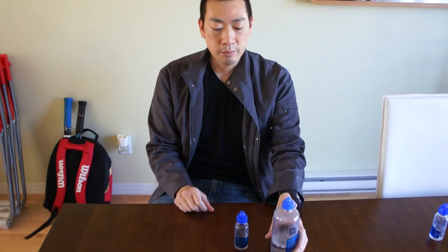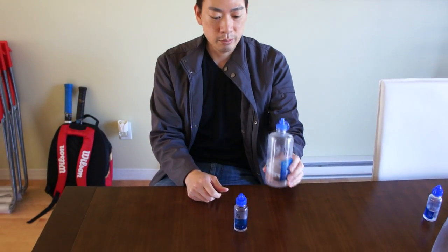So you don't have to spend as much money buying these small bottles — you can just buy a big bottle and refill it.